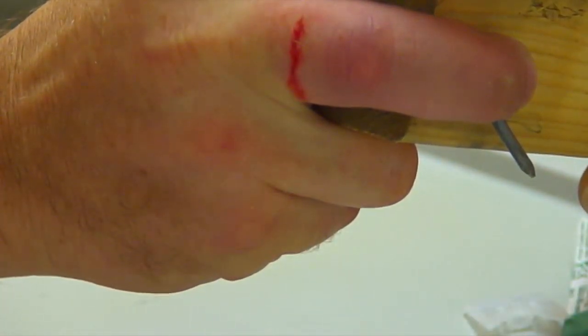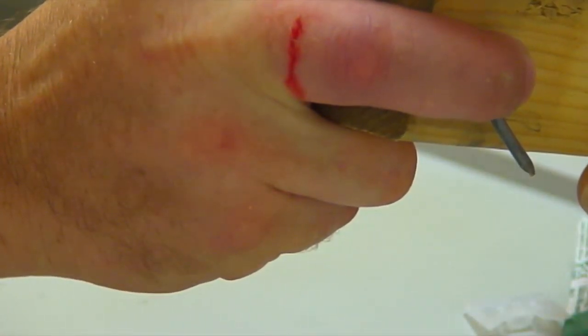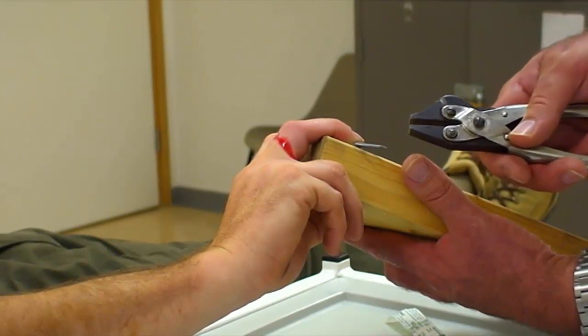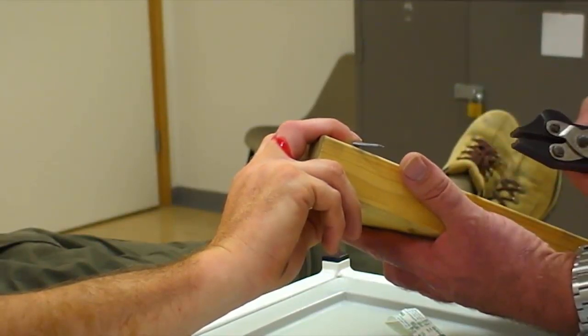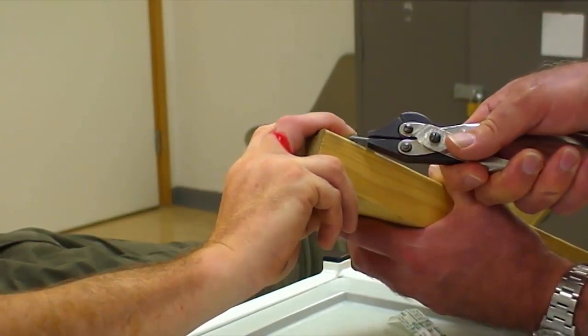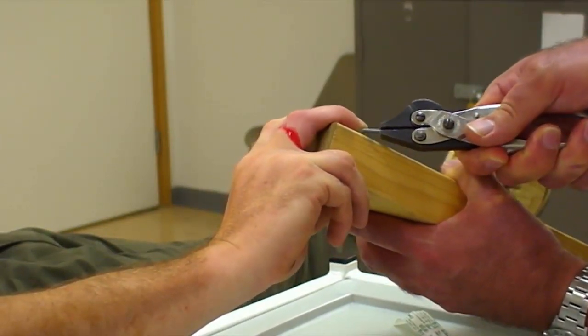I'm going to give that about 3 to 5 minutes to take effect. I'm going to cut it underneath, and I'll either cut it on my side. Obviously if it's uncomfortable, please say — just let your finger go with it.